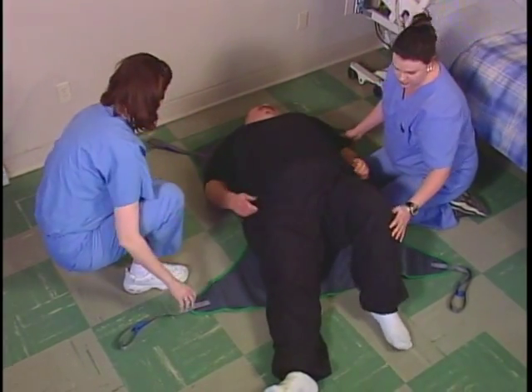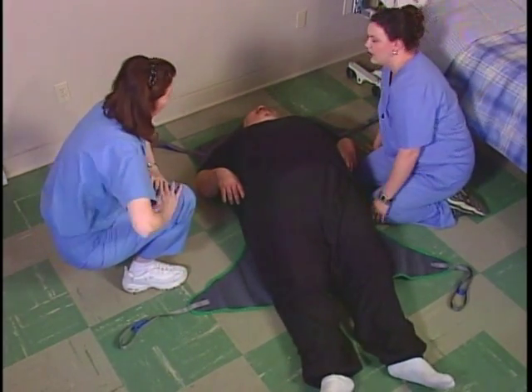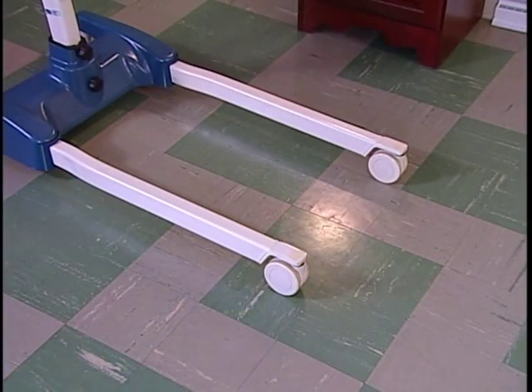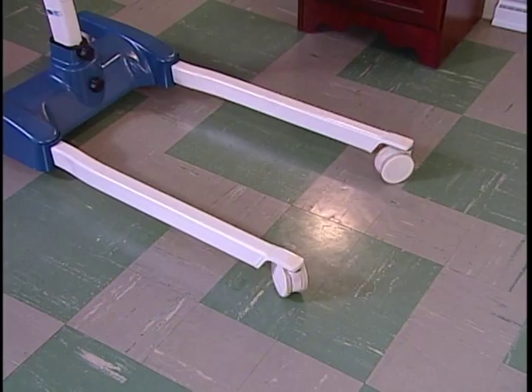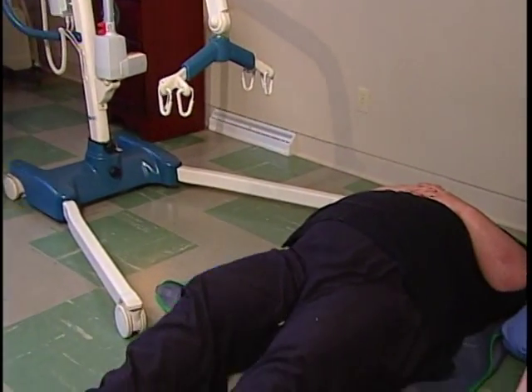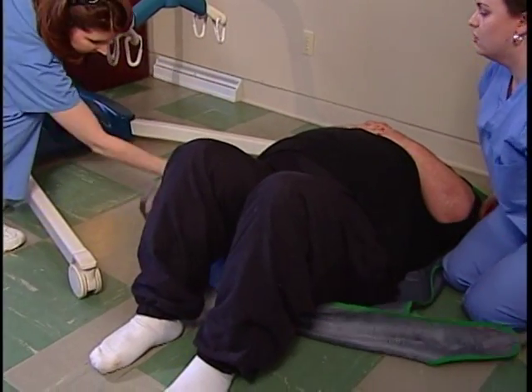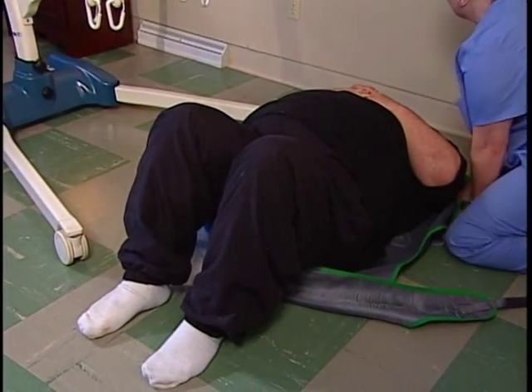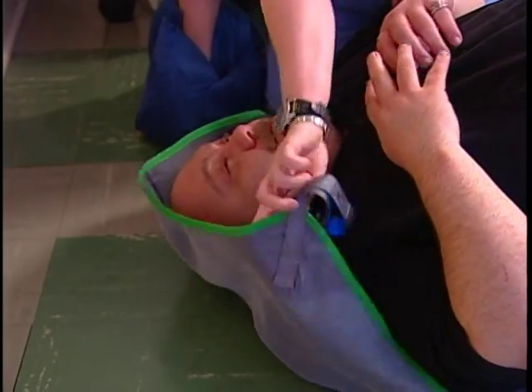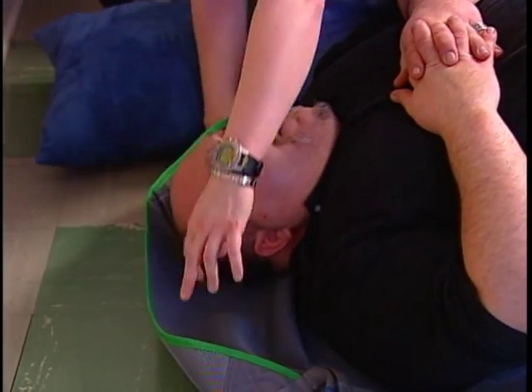The resident is rolled again onto their back, now centered on the sling. The lift is then moved into position over the resident. Make sure that the lift's legs are in the maximum open position for stability. Feet flat on the floor. Thank you. Carefully slide the lift under the resident. Have them bend their knees and hold their head up as you move the legs under them.